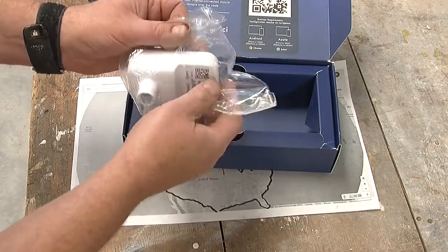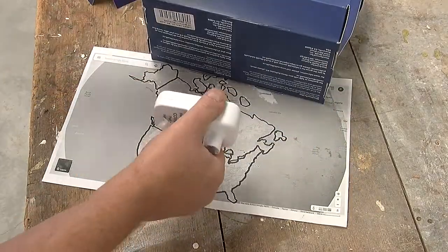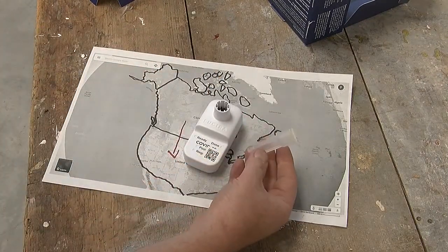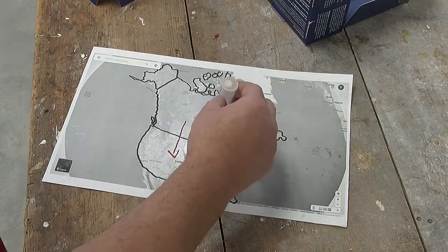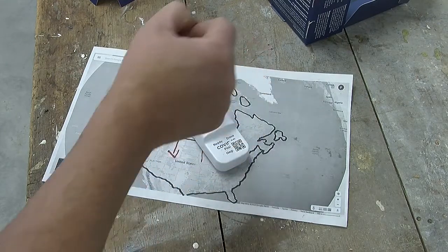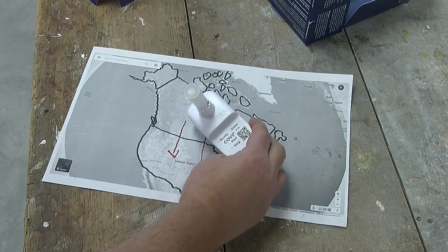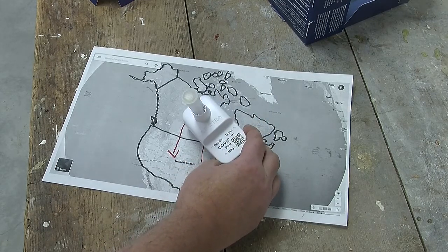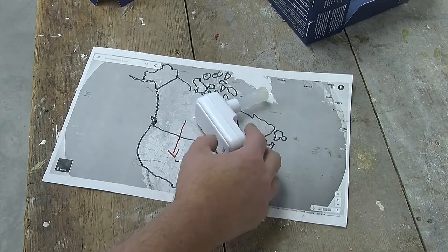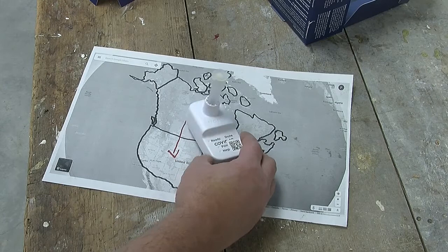But the neat thing here is in this test you get a little device like this, and you have a vial full of goop, and you put the vial full of goop in there, you do your nasal swab, you put your swab in the vial, and then you push it down, and then this little package here cooks for about, I think it's half an hour or so, and what it does is it heats the goop in there up to about 60 degrees Celsius, and that's actually the isothermal part of the test.